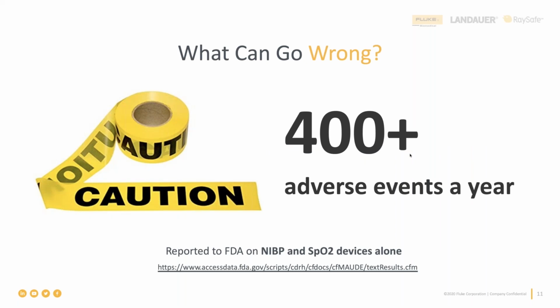And the reason why we make this claim is because we look at data, and in this case, specifically we look at FDA data, and we know that over 400 adverse events are reported to FDA every single year for NIBP and SpO2 events alone. And again, this data that we're showing here is reported to the FDA, which means that all of this happened in the US only, even though the medical device manufacturer can be located overseas.